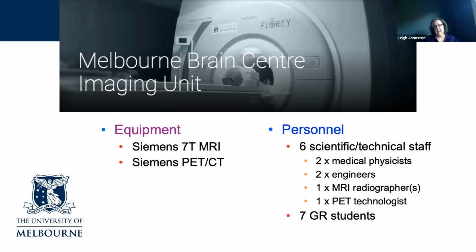And that's why, cutting edge is probably 11.7T, and there's maybe 2 of those systems around the world. But 7T scanners, there's probably about 100 of them, maybe a bit more, in existence around the world. So they're certainly not your stock standard scanners. And it allows us to do types of imaging that are just not feasible at lower field strengths.